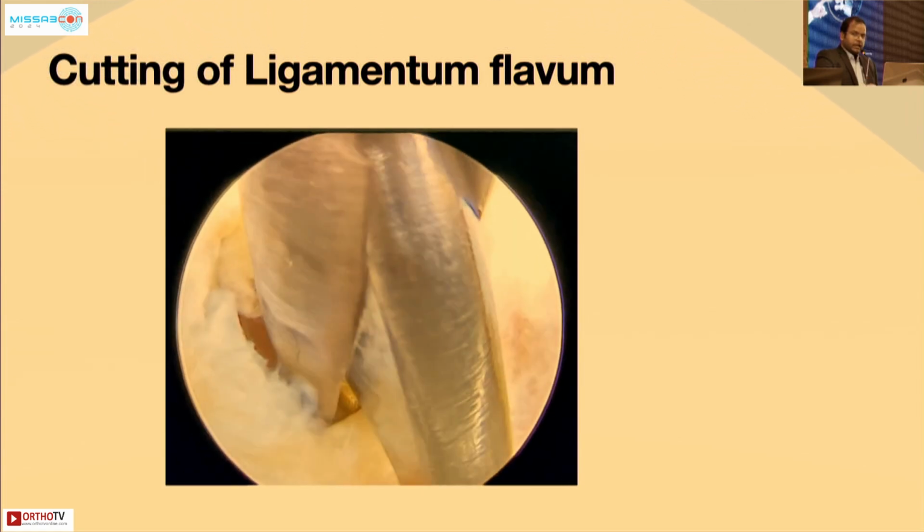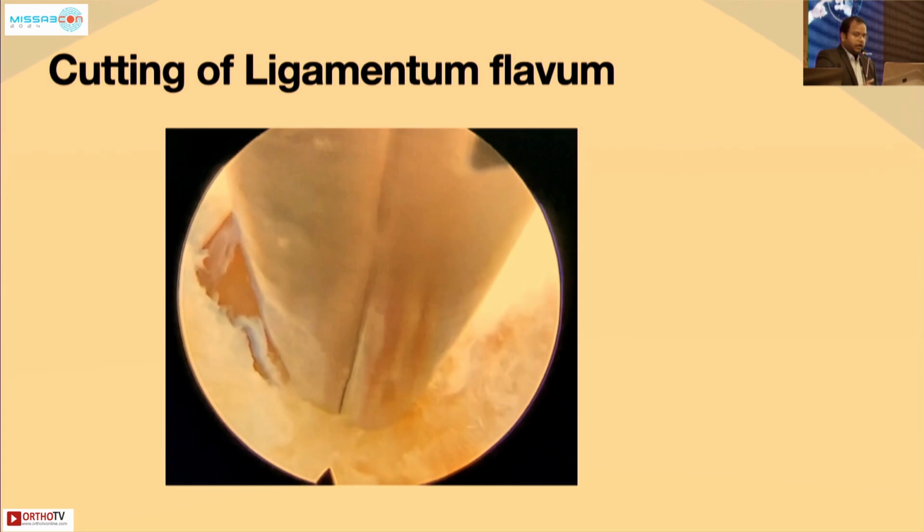Your saline will already partly hydrodissect the thecal sac and will create a dead space there. But you have to be very careful.